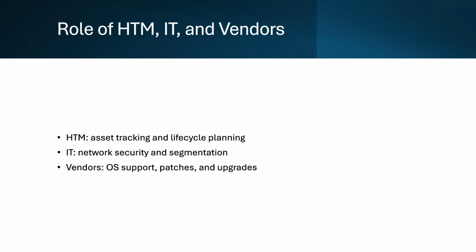IT teams secure the network and enforce cybersecurity policies. They implement network segmentation, monitor for threats, and respond to security incidents. Collaboration between HTM and IT is essential. You need to speak each other's language and understand each other's priorities.